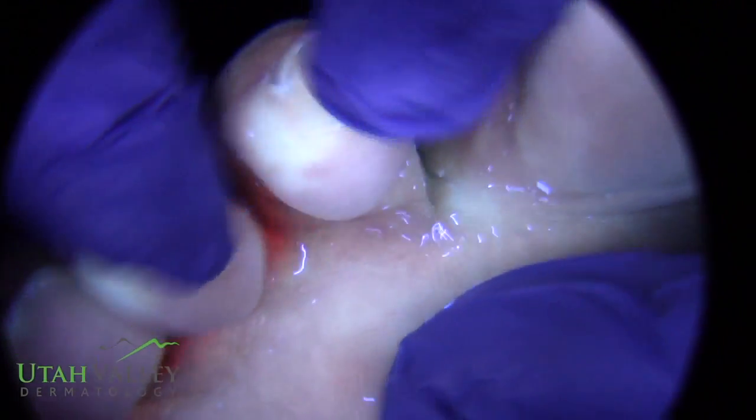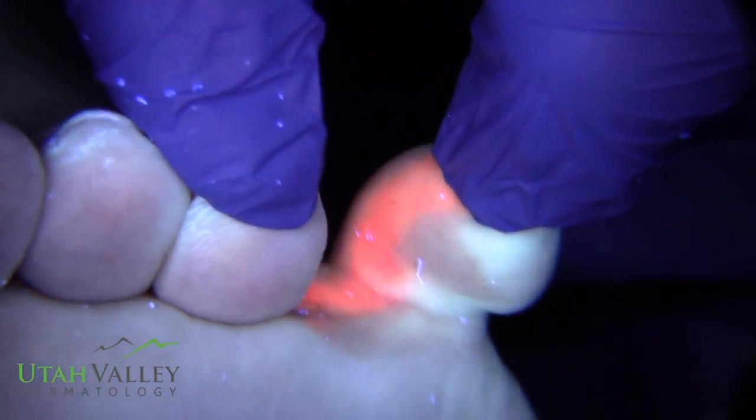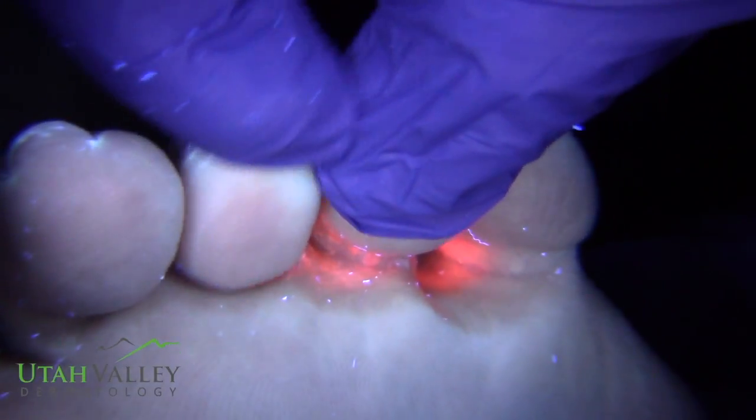This isn't just on this foot — nothing in there on that one. Let's see this foot here. All this is is a simple black light. We call this a Woods lamp, but it's a black light.